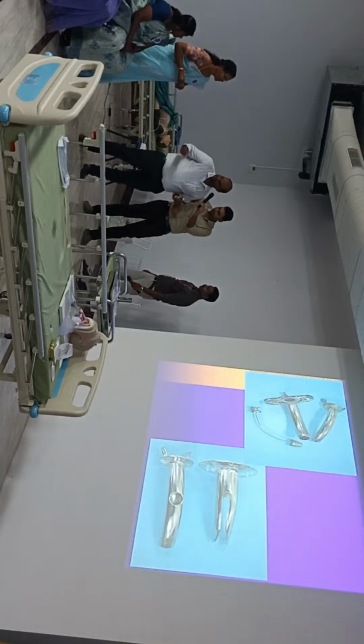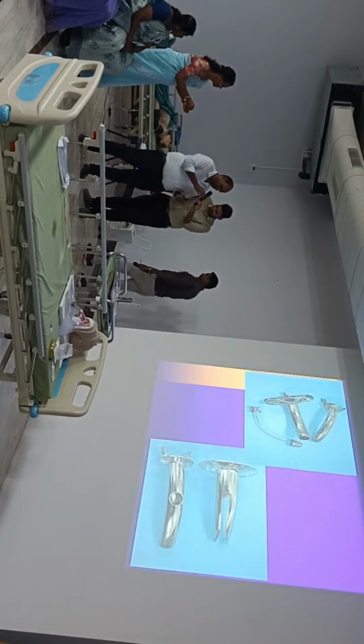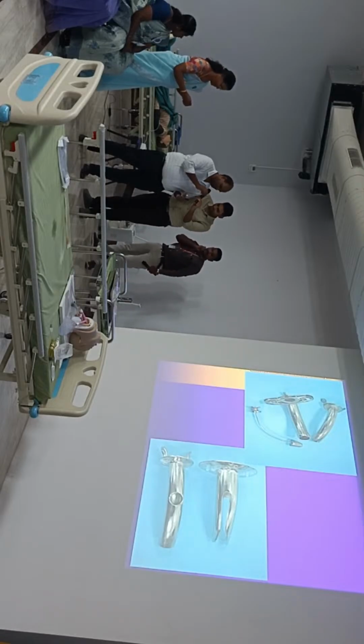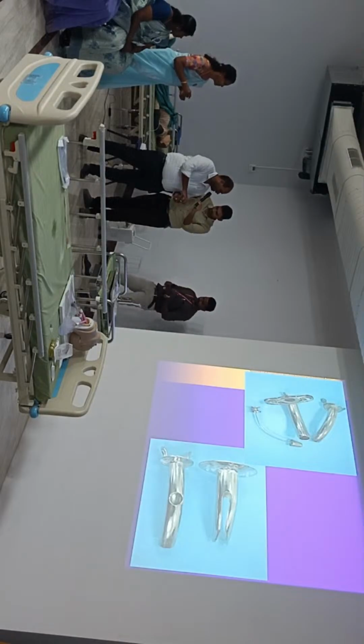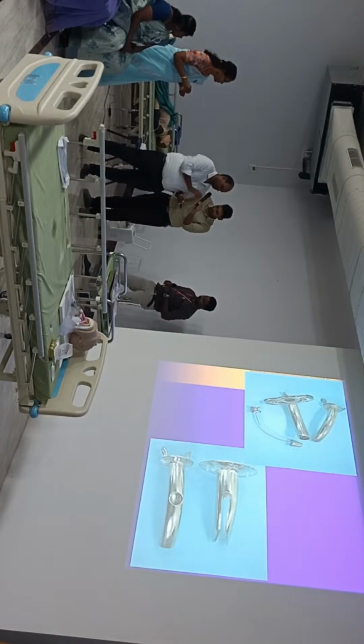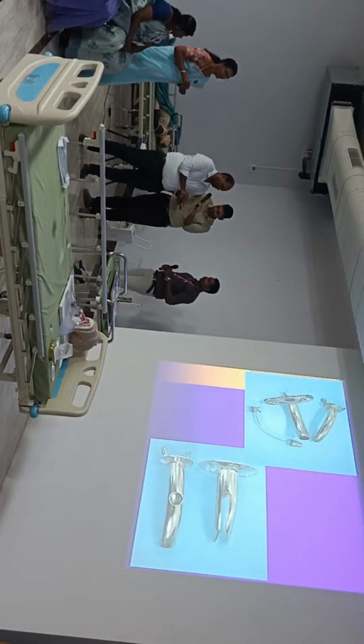Another thing is, both the tubes are at the same level, isn't it? So, if the tube gets occluded, the entire tube will get blocked, isn't it? So, why do you think this lock is made? Just common sense.